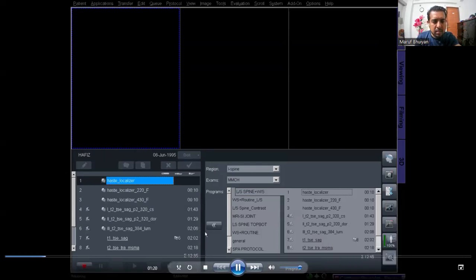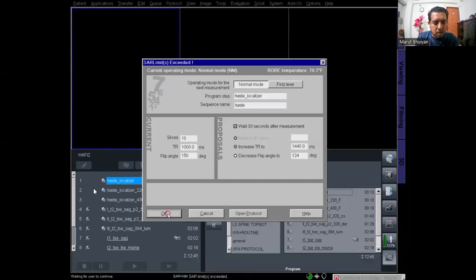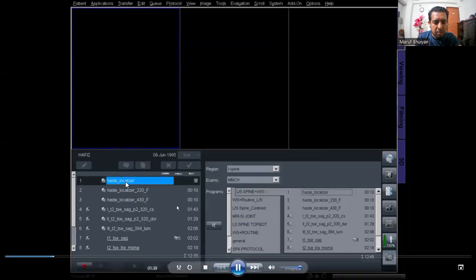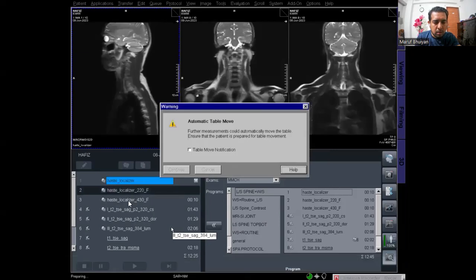Now the scan is started. Look — there are three protocols: the first HASTE localizer, the second HASTE localizer, and then another HASTE localizer. These three localizers are for the cervical, dorsal, and lumbar spine. The first one is the cervical localizer, the second is the dorsal localizer, and the third is the lumbar localizer.